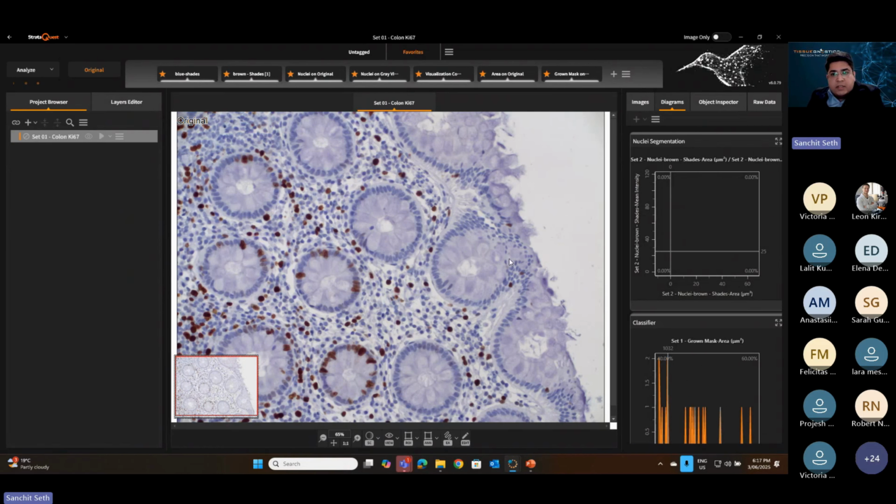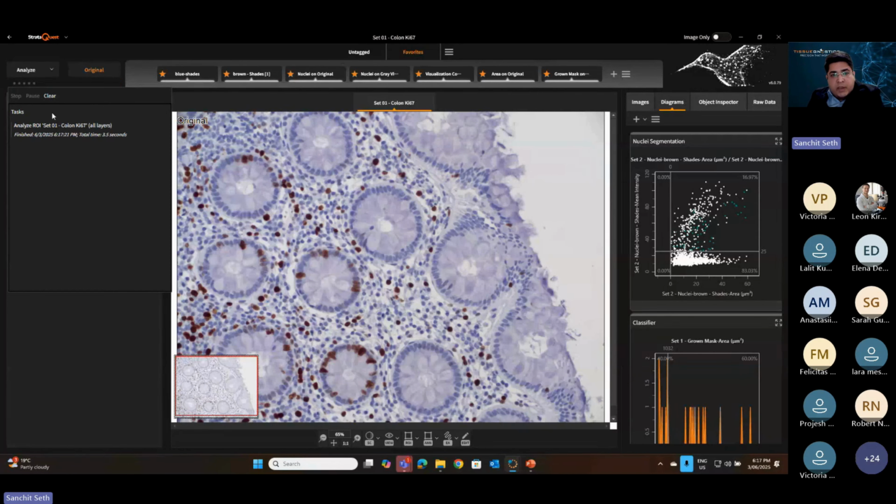And you can see when the sample is run, you can have on the taskbar where all the summarized data will be, that your sample is running, and if there are multiple samples in a project, they can be aligned in the list and they can be seen here.